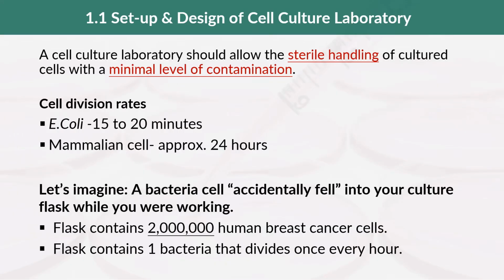Okay, in the setup and design of a cell culture lab, a cell culture lab should always, okay, allow sterile handling of cultured cells with extremely minimal level of contamination. Sterile means very, very clean, absolutely clean, highest level of cleanliness. All right, why? Why is this important?